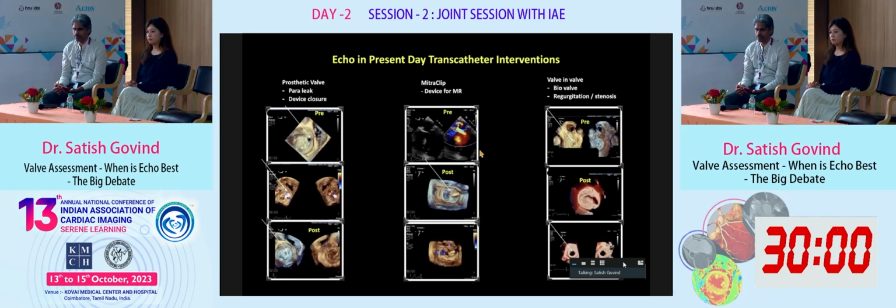And there is MitraClip over there. Again, echo plays an invaluable role for MitraClip, and also valve-in-valve. So again, echo is complementary, and other imaging modalities are also very useful.